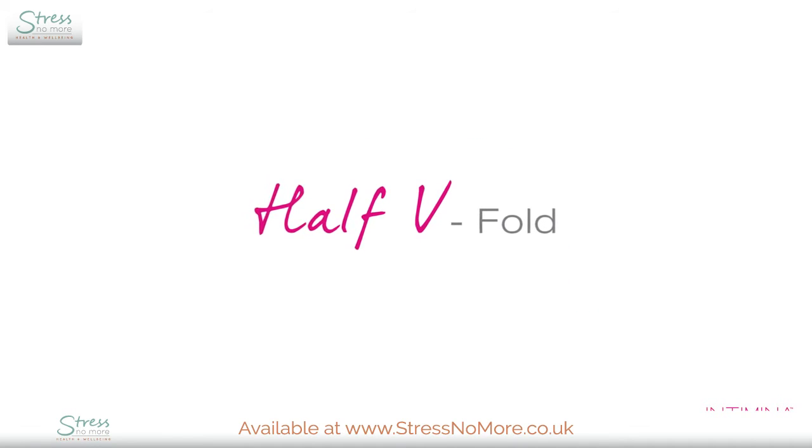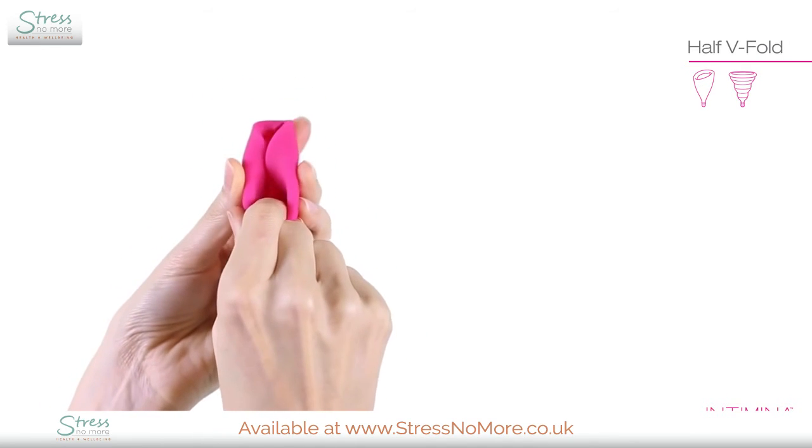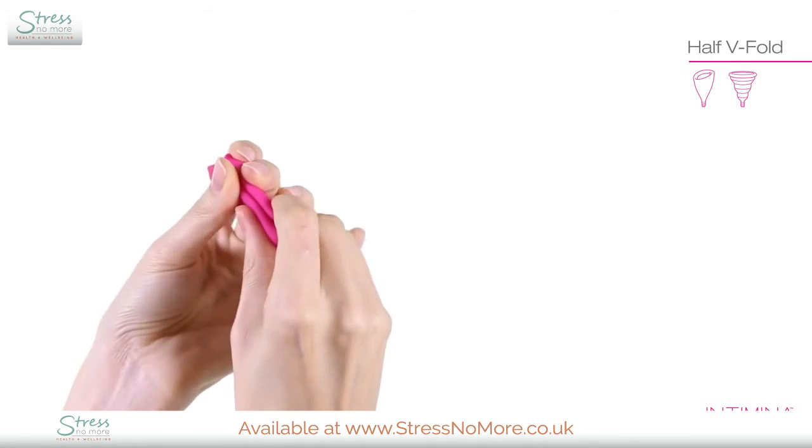The half fold works well for both cups. Push the rim down, then hold the body of the cup.